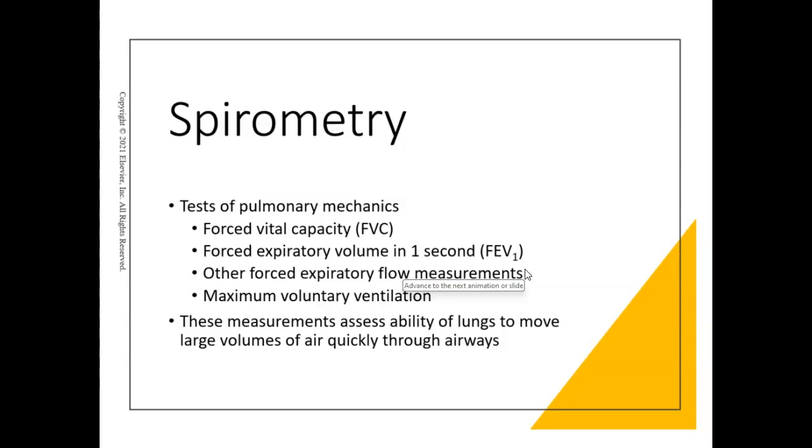When you're doing this measurement, you need to coach the patient to reach their inspiratory capacity, which is the total volume of air you can get into the patient's lung during inspiration. That's not just tidal volume, it's taking that big deep breath in.